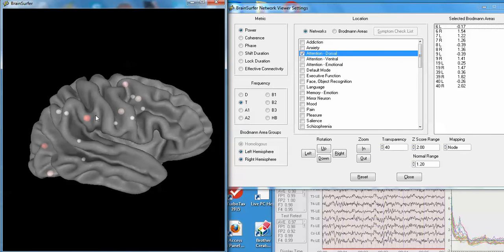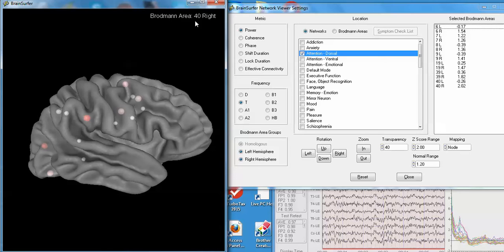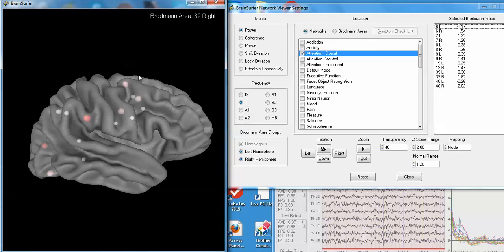If you want to know which Brodman area this is, you move the mouse to the sphere representing the Brodman area, and then right mouse click. You can see that's Brodman area 40 right. Here you can right mouse click and see that it's Brodman area 39 right. If you go anywhere on the screen and right mouse click, it will disappear.